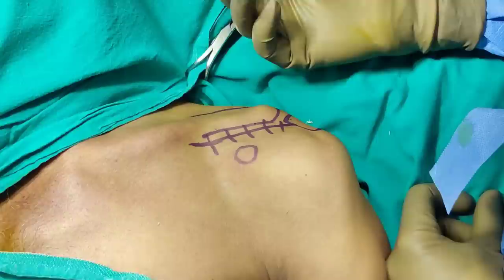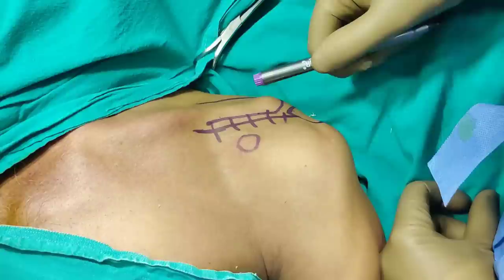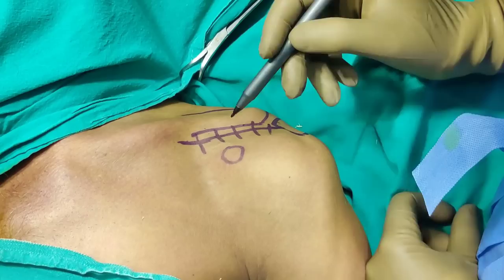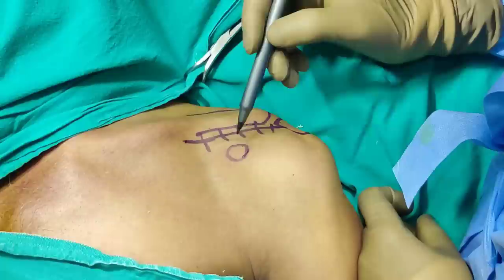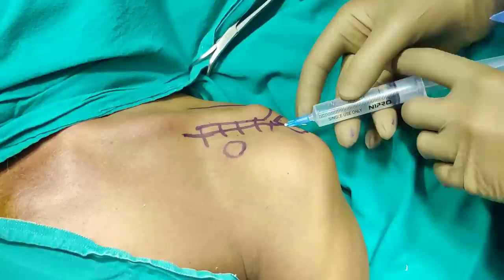I recommend starting every surgery by using a marking pen. Marking a skin incision is a very good practice. So this is your landmark: this is the lateral end of the clavicle — you can see this bulge very clearly. This is roughly the acromion, and this is the coracoid which I have felt here. I am going to use a horizontal incision just inferior to the clavicle, centered over the coracoid so that you have access medially as well as laterally. Before any surgery around the acromioclavicular joint, always use local anesthetic with adrenaline to reduce bleeding, as it is quite a vascular area.